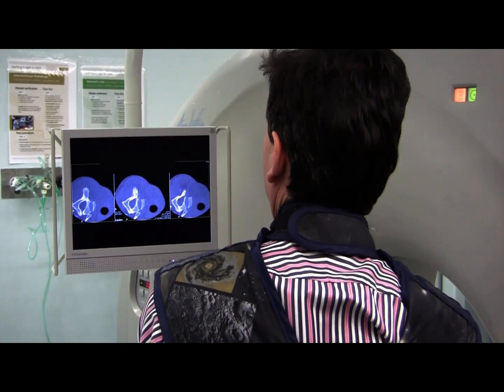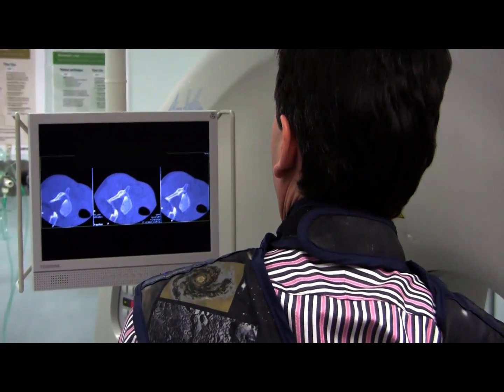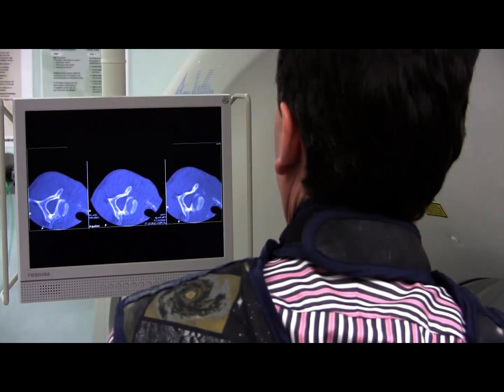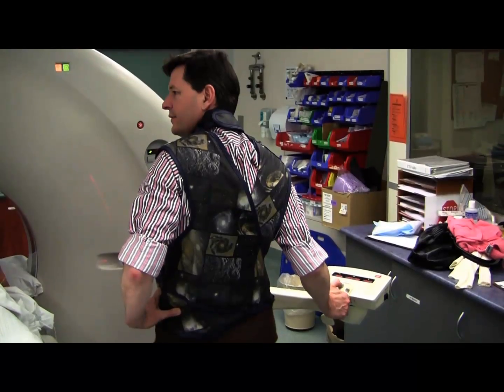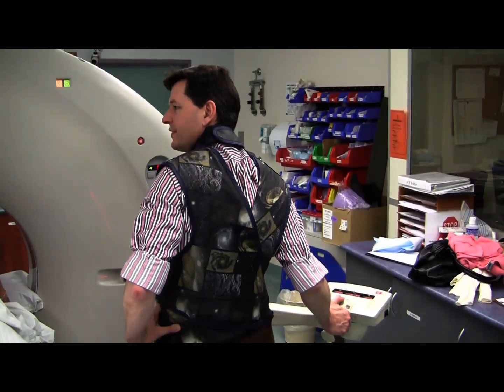T1 — so that's 7-1, coming through 6-7, and then 5-6, which is there.